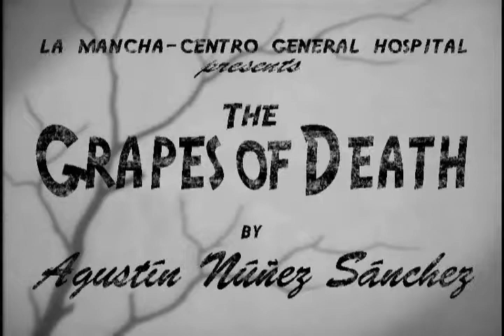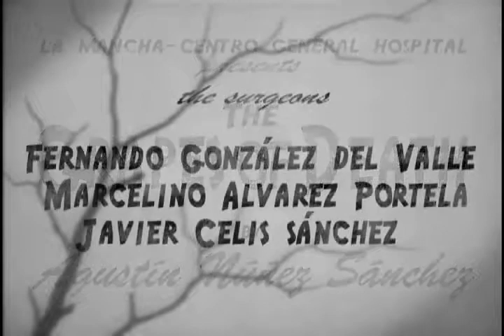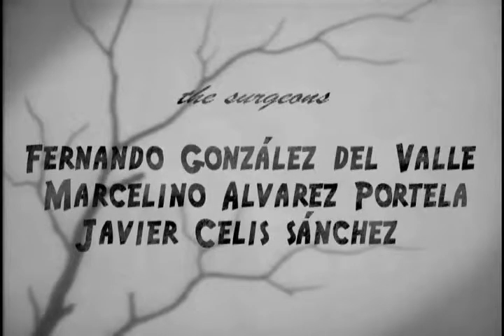The grapes of death: uveal dissection for scleral, corneal and scleral donor tissue obtention, an anatomical approach.